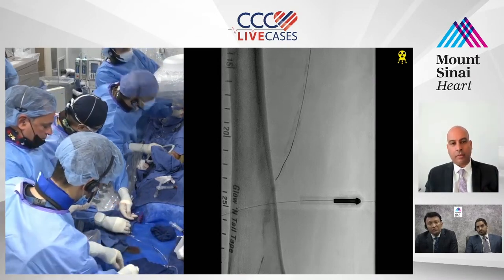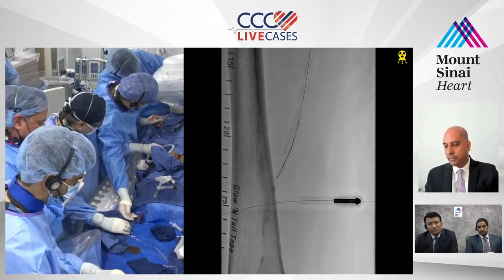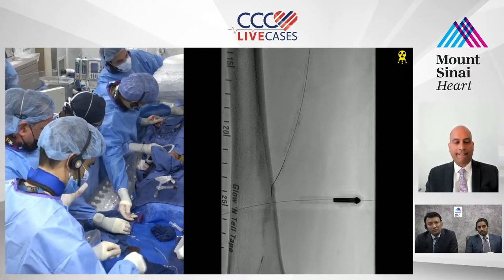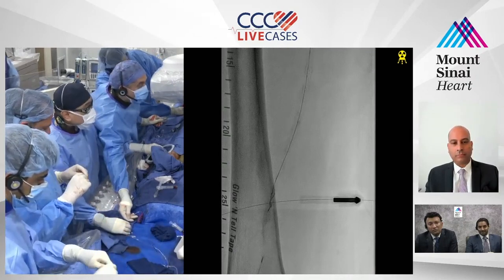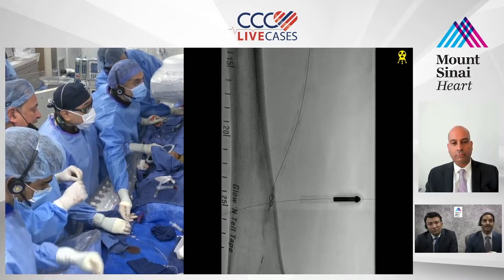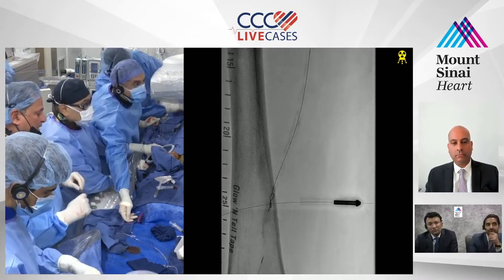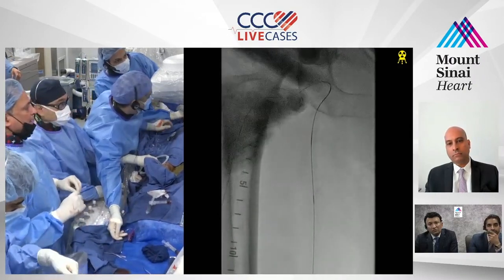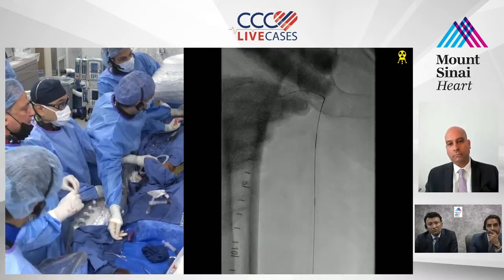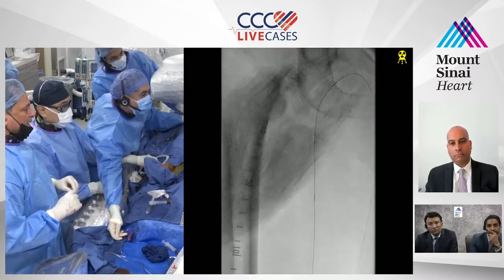I probably would go from below, because maybe we get a better channel down below too, right? Guys, there's no question you have to go from below with this access, because I think Srini's just being very nice. The bottom line is, if you put a sheath in that SFA and then you're working with that sheath, you're creating a whole different set of problems. Here you're going to have no problem getting the pedal sheath out. But from above, if you put a sheath, I think you're going to have issues.